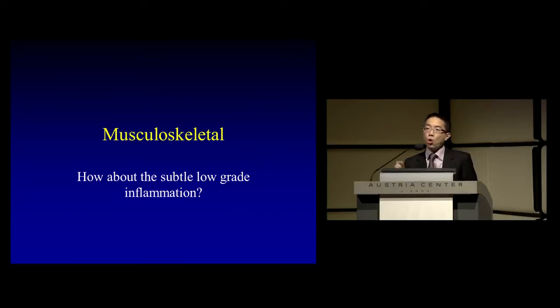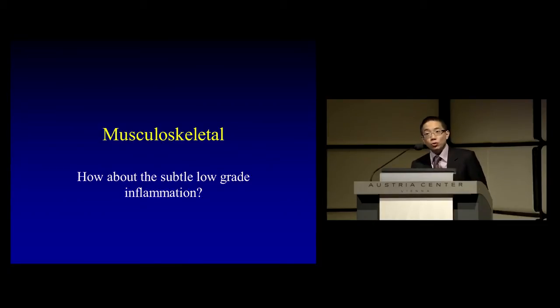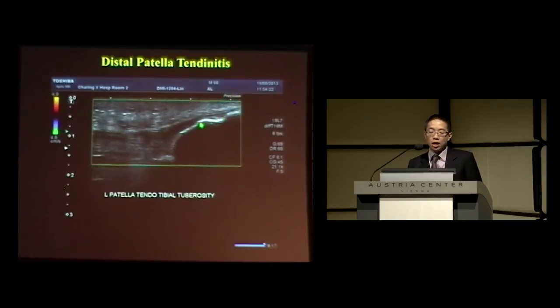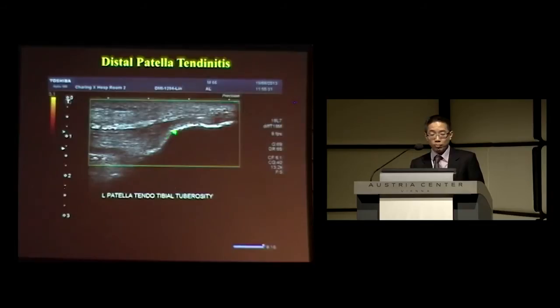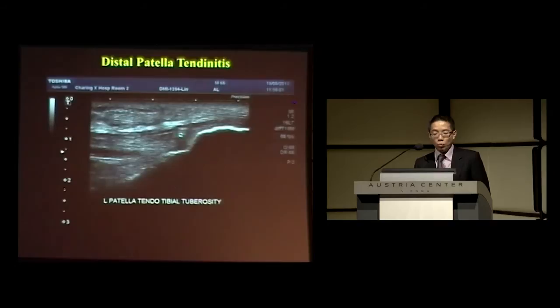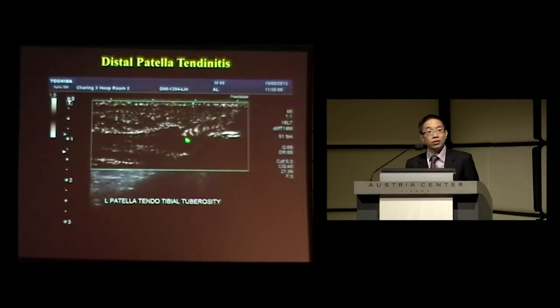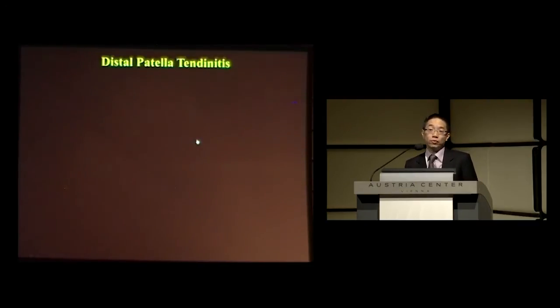The clinical question is: what about the low-grade inflammation that we do not normally detect? There are many patients where we don't see anything on Power Doppler and say there is no active synovitis. Here is an example of a patient who complained of knee pain on the medial aspect. This is the patellar tendon attaching to the tibia, the site of tenderness. There's not much to see on B mode or Power Doppler. But watch what happens when we turn on SMI — suddenly you see this meshwork of extra vessels indicating extra vascularity in this portion of the tendon, indicating tendonitis. I was confident to give this patient a steroid injection into that region.